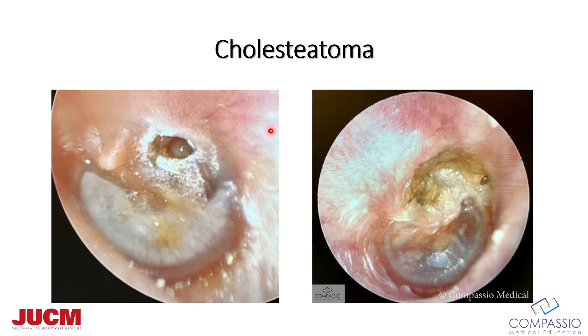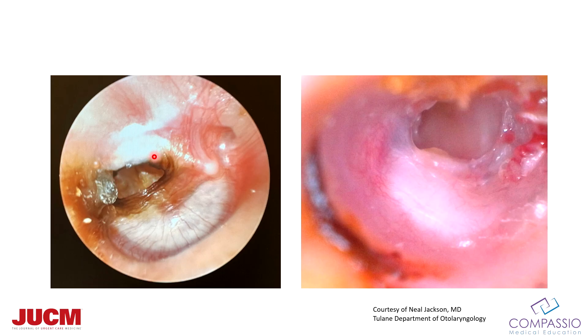Next up, cholesteatoma — you definitely want to refer these patients to the ENT provider as well. The most common locations are the same as retraction pockets: pars flaccida and the posterior superior aspect of the TM. Here's one on the left ear, posterior superior, eroding into that space — it's basically epidermis going into the middle ear. This right ear shows the whole pars flaccida and posterior superior quadrant eroding bone. Another place cholesteatomas may form is through an existing TM perforation. Here's a right ear with a TM perforation and a cholesteatoma starting to form, and here's a nice pearly cholesteatoma from migration of epithelium into the TM perforation. This is courtesy of Dr. Neil Jackson at Tulane University.